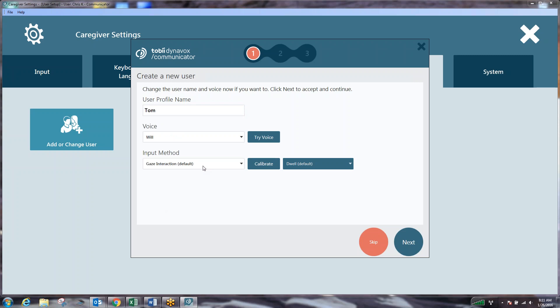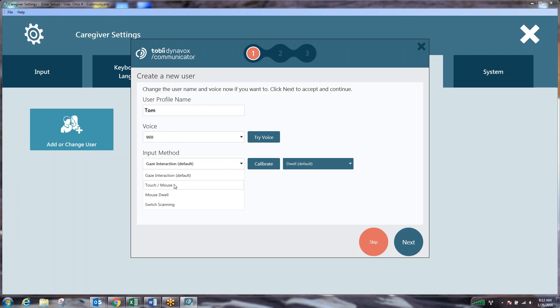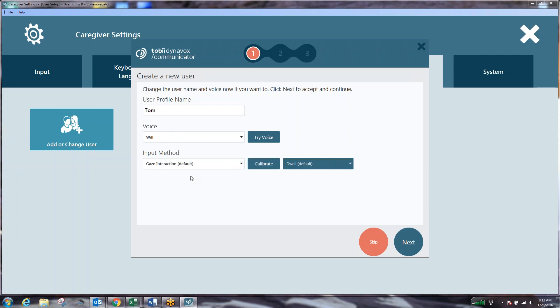Then we can determine which input method we're going to use. If you have a device that does not have gaze interaction installed you'll see red text at the bottom that says no gaze interaction connected. If you're using touch screen you would want to drop the input method down and make it a touch/mouse access method. If you are using eye gaze you can just leave it on gaze interaction as a default.